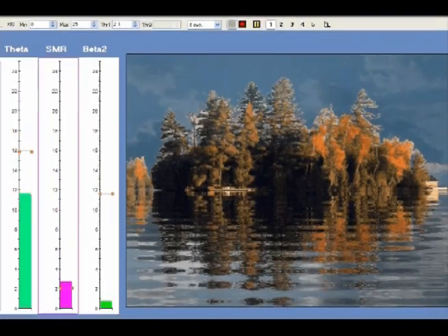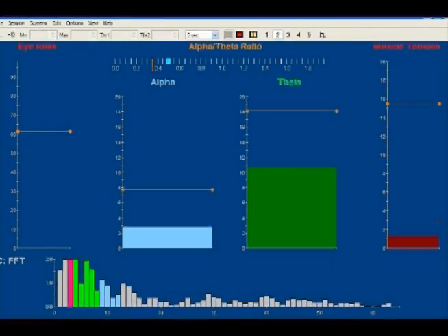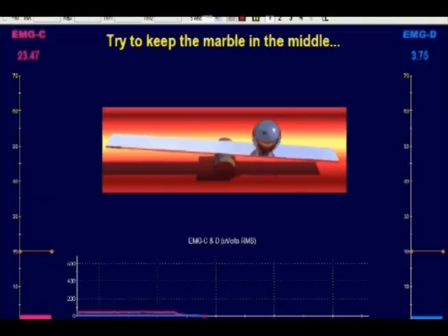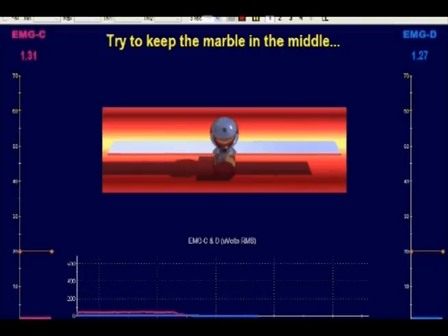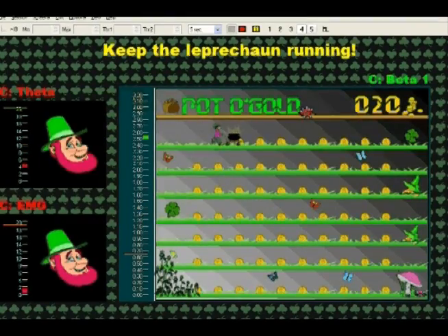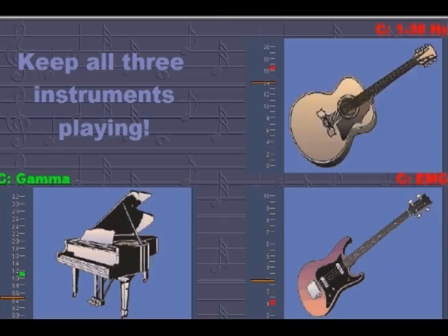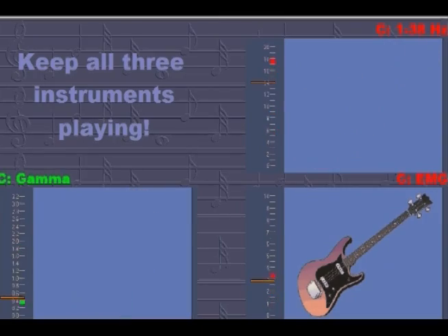Variety can also be enhanced by toggling between up to five screens, which automatically place a time mark in the data to indicate which screen was being used. The time marks appear in the review screen and printable reports.